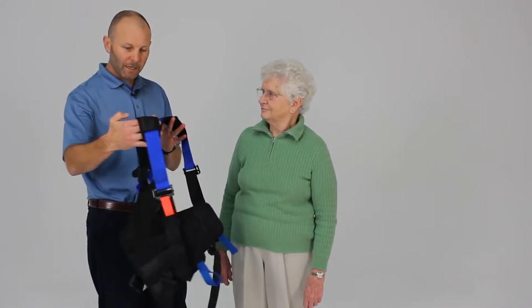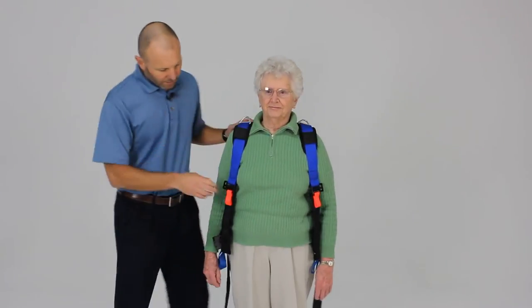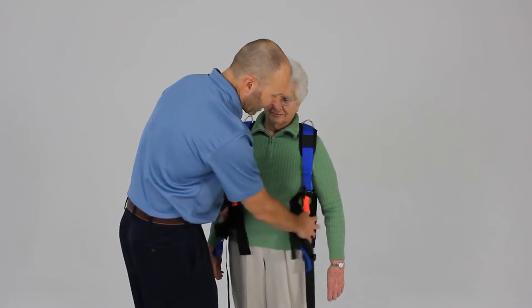First, you're going to place the upper piece just like a vest onto the patient. You're going to want to then adjust the shoulder strap so that you position the belt around the waist area.